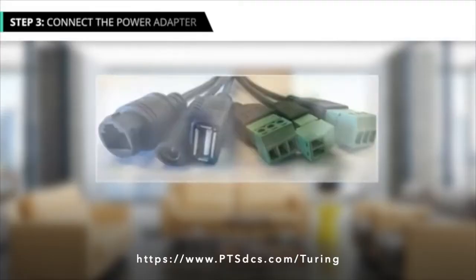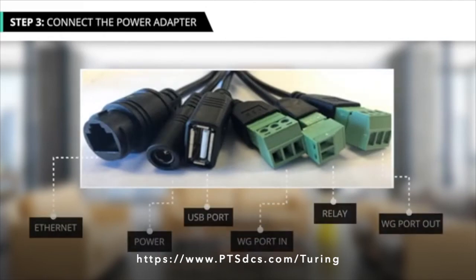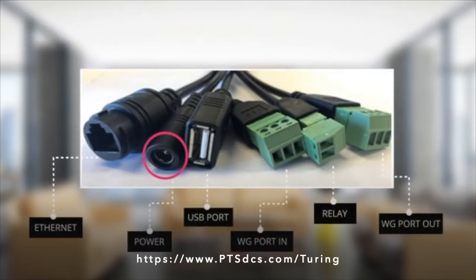The cord coming out of the back of the scanner has 6 ports, one of which is the power cable. While you can use the external data ports when required, the basic operation of the scanner does not require any other connection other than the 12-volt power cable.